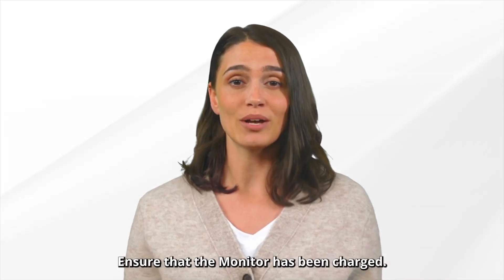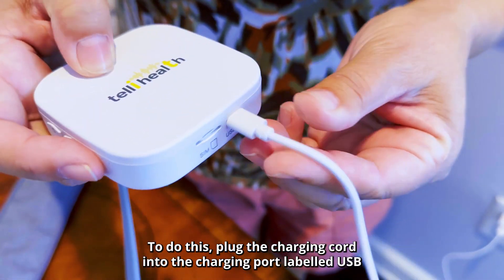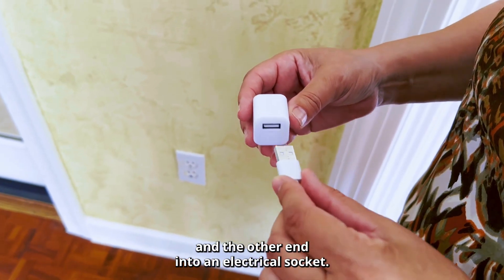Ensure that the monitor has been charged. To do this, plug the charging cord into the charging port labeled USB and the other end into an electrical socket.